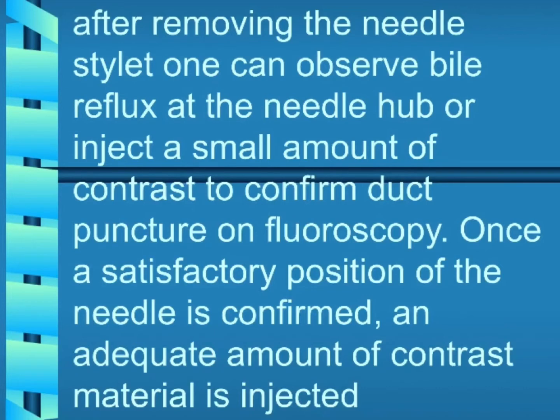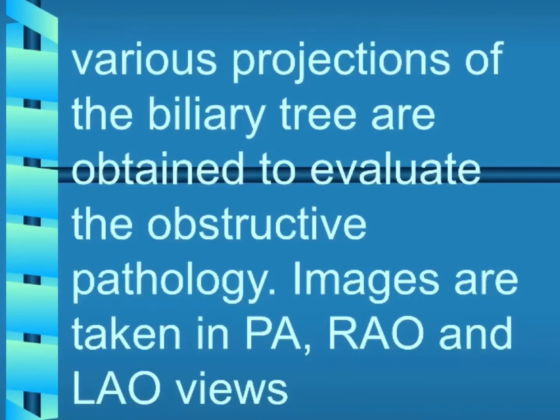Once a satisfactory position of the needle is confirmed, an adequate amount of contrast material is injected. Various projections of the biliary tree are obtained to evaluate the obstructive pathology. Images are taken in PA, RAO, and LAO views.